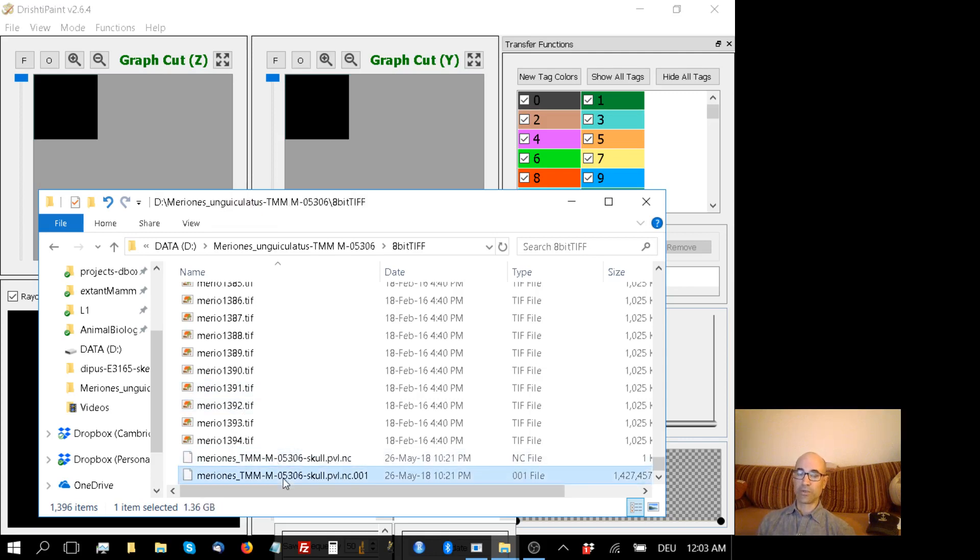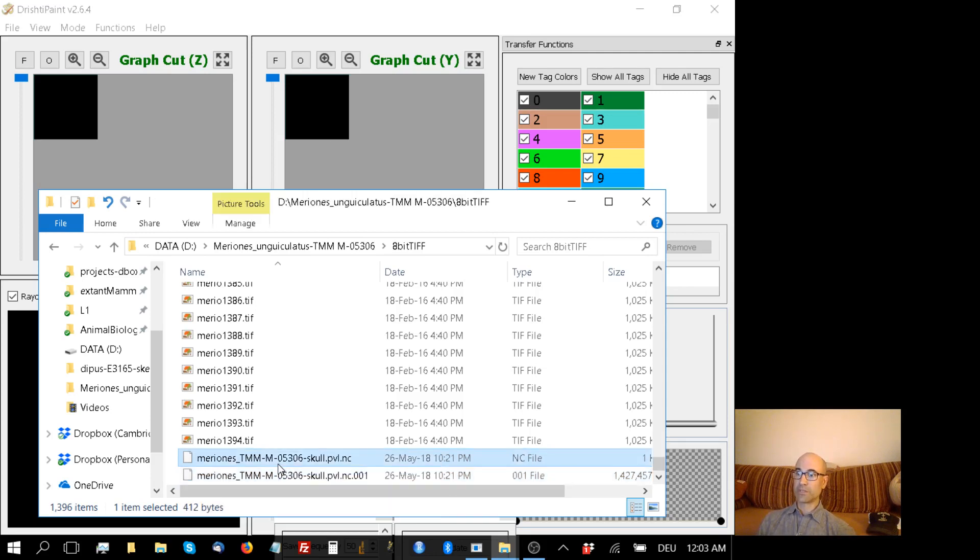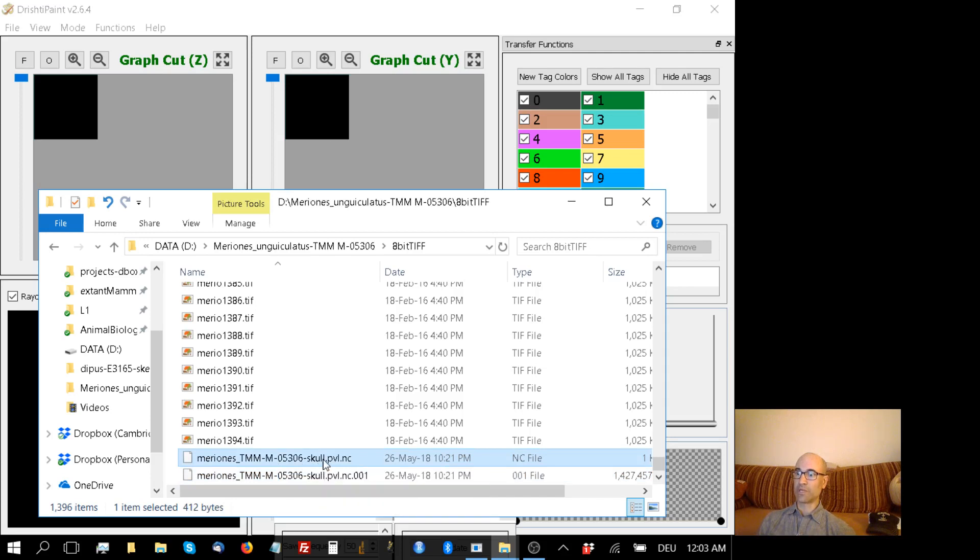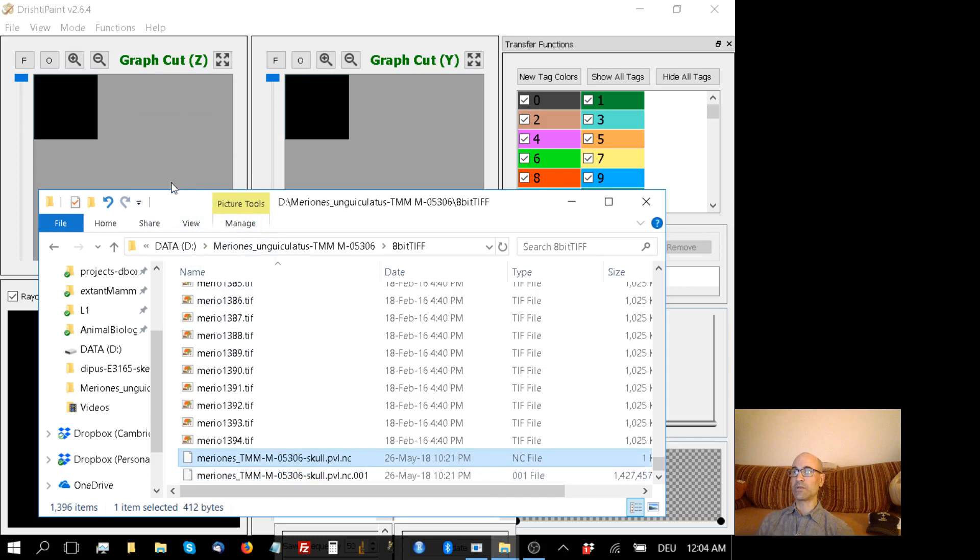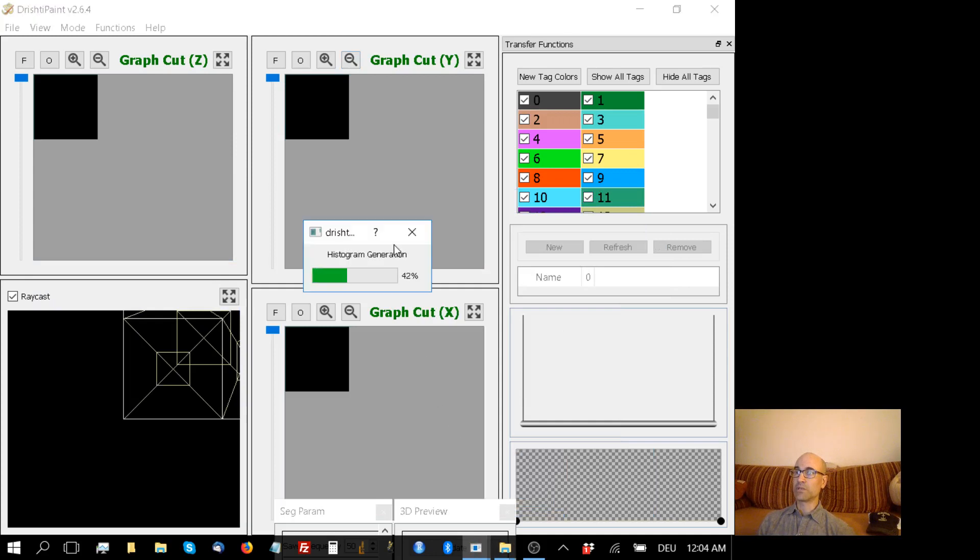The next thing I'd like to show you is how to use a different part of Drishti, namely Drishti Paint, to render those volumetric files and do basic things like segmentation. So here's the PVLNC header, and to open this, all I need to do is drag the little 1K header file into any one of these Drishti Paint windows. And once I do that, you can see Drishti is starting to generate a histogram.